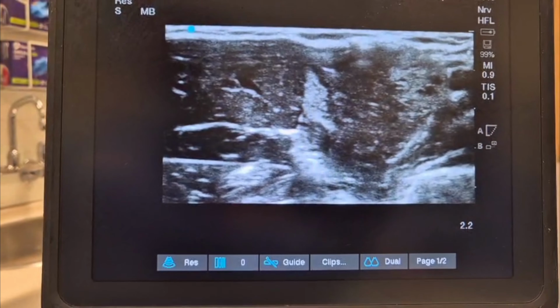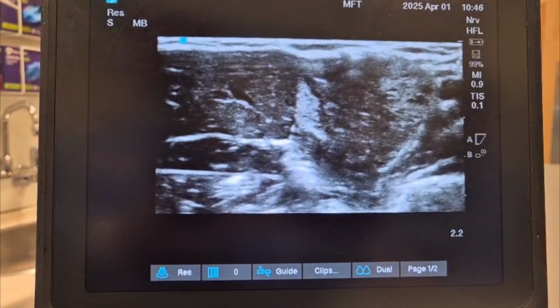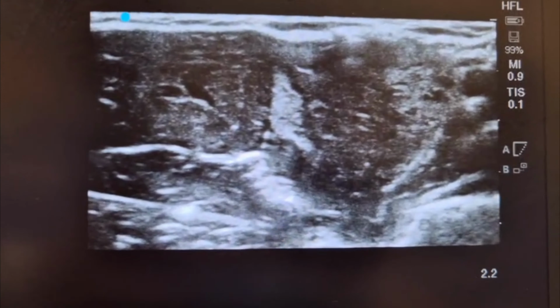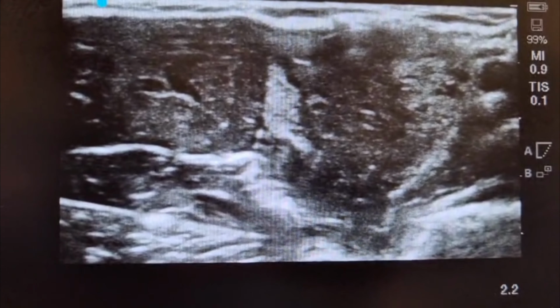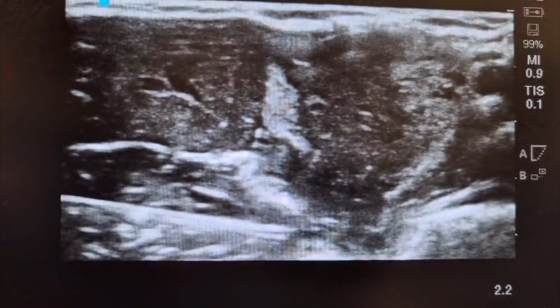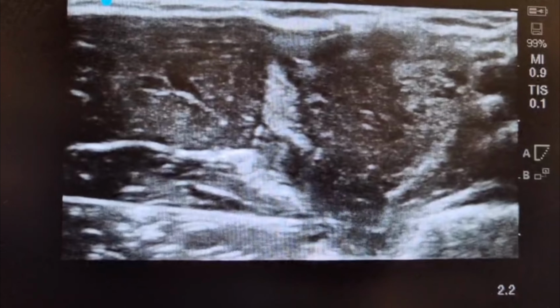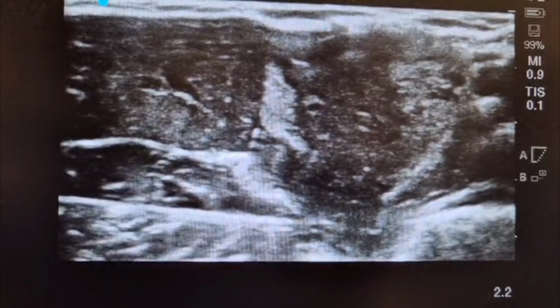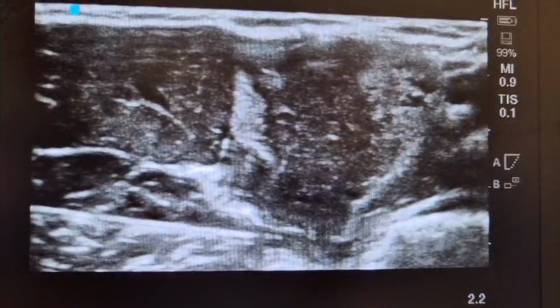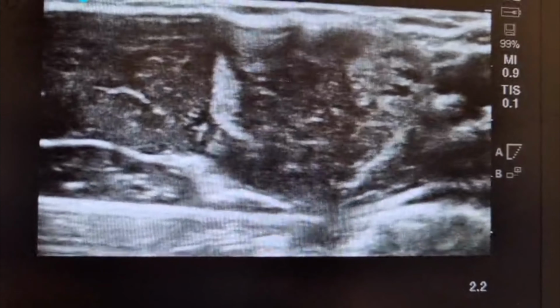If you could push your needle head slightly underneath, maybe. Yeah. Good. Bit closer, bit closer. Yeah, that's good. A bit more. Keep pushing. Yeah, that's okay. That's enough. You could catch the artery now, and we will go underneath the musculus, inject to the posterior. Push.